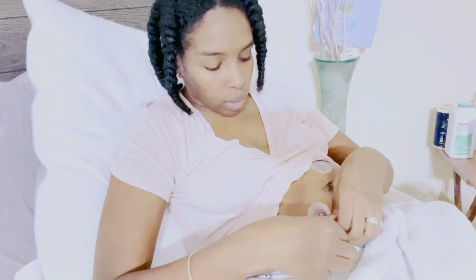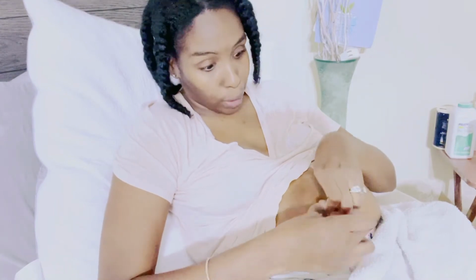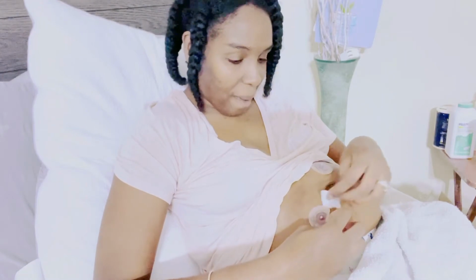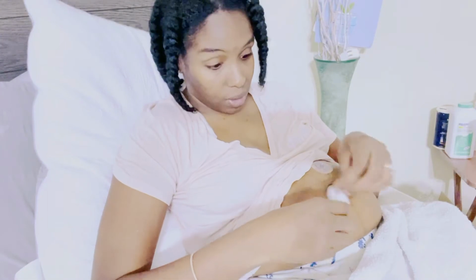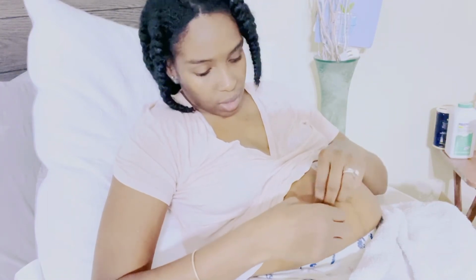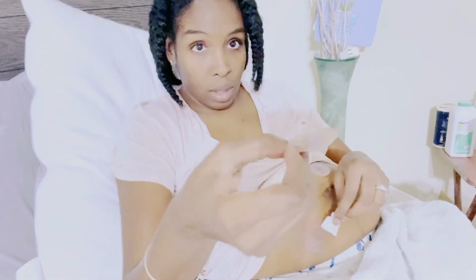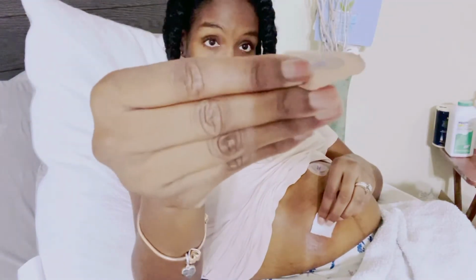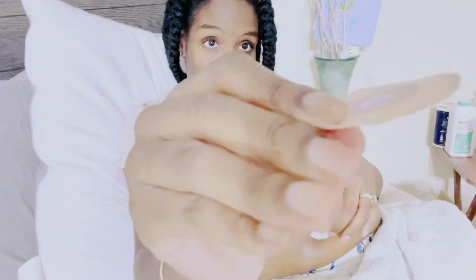Ooh, this is really on there, especially, oh, I must have a piece of hair right there. I'm hairy, y'all. All right, so this is one of those types of tapes that just really be sticking to your skin. Ooh, so now I'm just gonna pull this out. See, that's the catheter that was in there. Oops, hold on. That was in my skin. Ooh, can you see it?